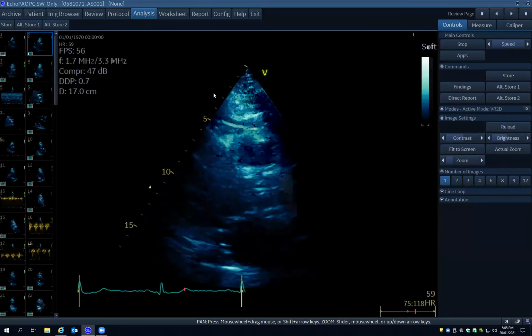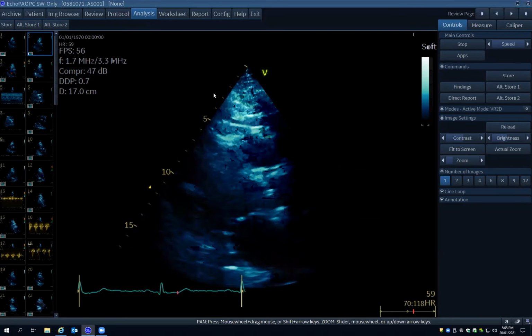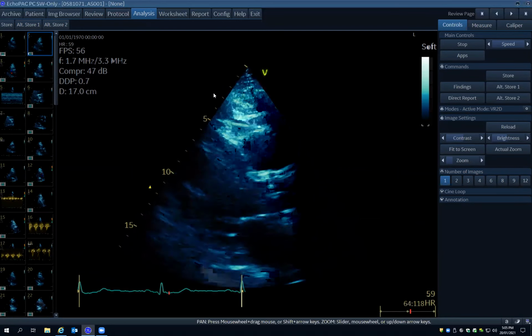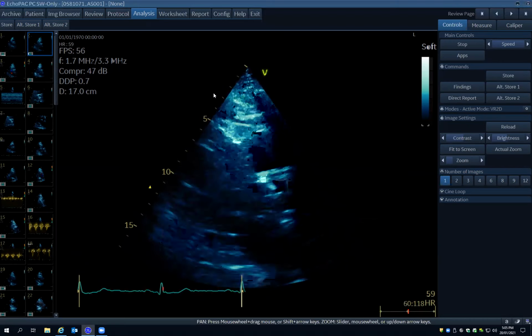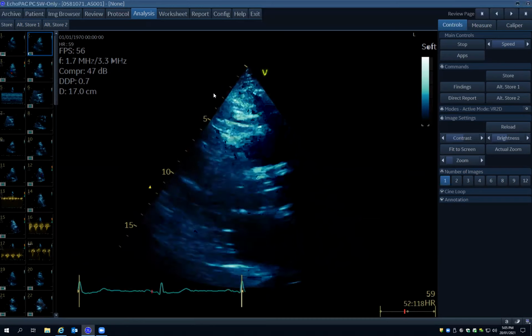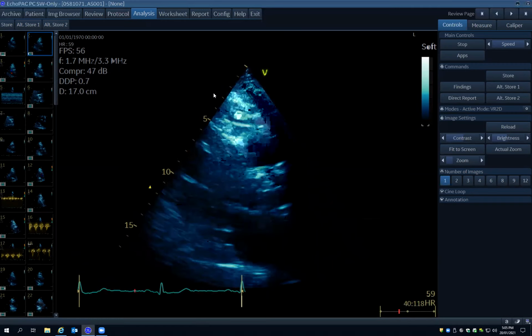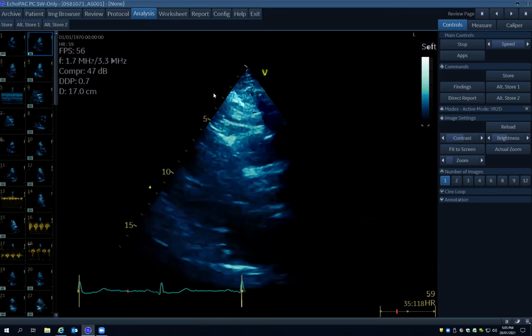I guess it's a pretty challenging view to start off with, first of all. But that's okay. I think we not infrequently see suboptimal imaging because of patient body habitus, their inability to be positioned, and you have to work with what you have. So first thing would be to try to see if you can optimize this image by looking for additional windows, trying respiratory maneuvers, but say this is what we have in the end.